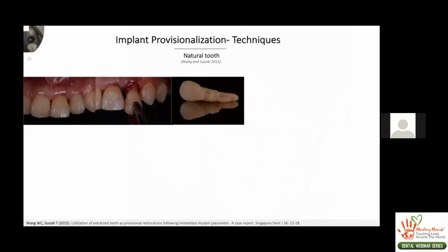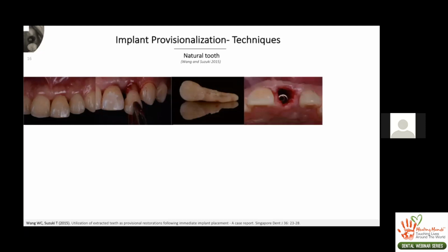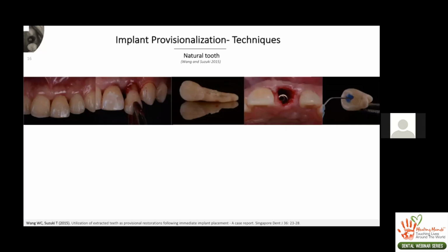And very importantly, the materials that we have available to us, like resin materials and whatnot, much more easily bond to the natural tooth than other materials that they're not compatible with. So this is a paper that came out in 2015, and they really documented it well. This is a natural tooth that they've taken out, placed the implant. With the natural tooth, what you're going to have to do is completely section off the root and make the tooth almost hollow, where you would have your temporary abutment coming out. And then also go ahead and develop more toward the transgingival area. You're going to have to add material to exactly how you would want your contours to be.